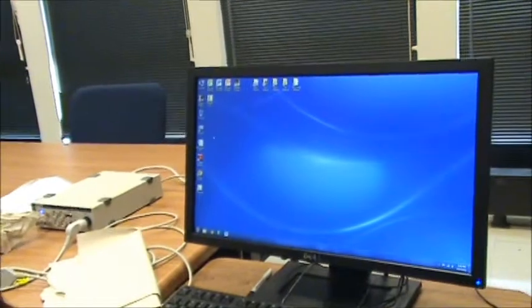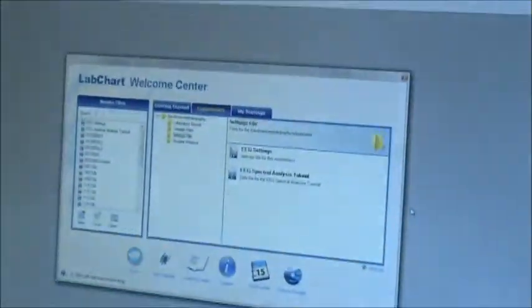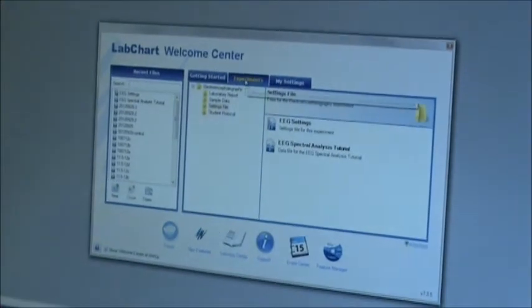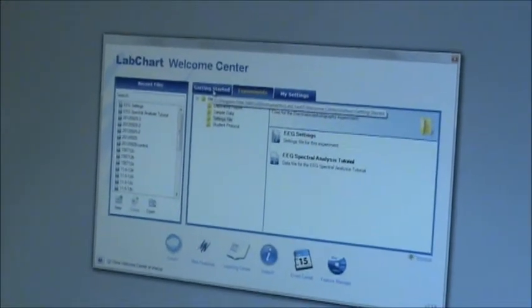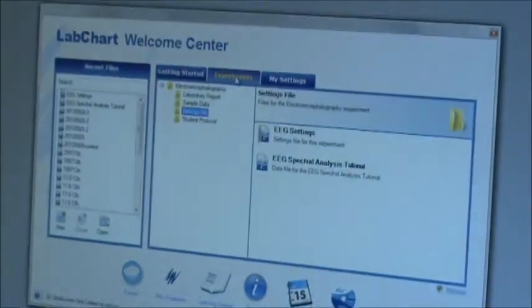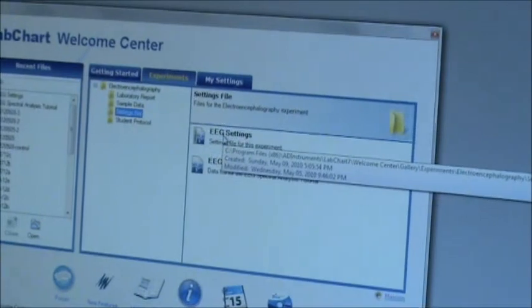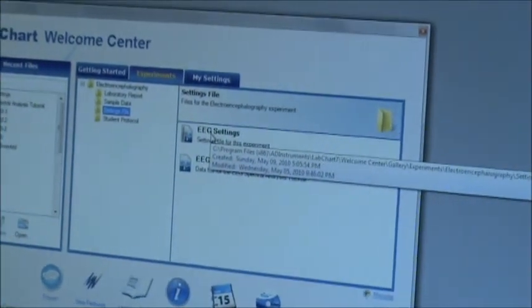Our next step will be to turn on the computer program. We load Lab Chart 7 and this should pull up a new experiments tab. Sometimes it may start off under 'Get Started' but just be sure to click on Experiments. Your lab chart should already be loaded with EEG settings, so just click that and press Start and you're already recording.